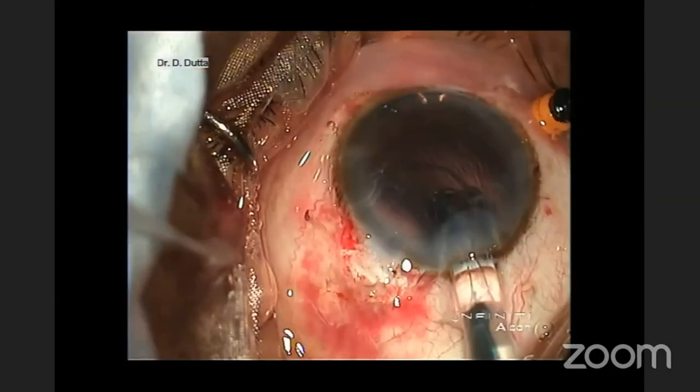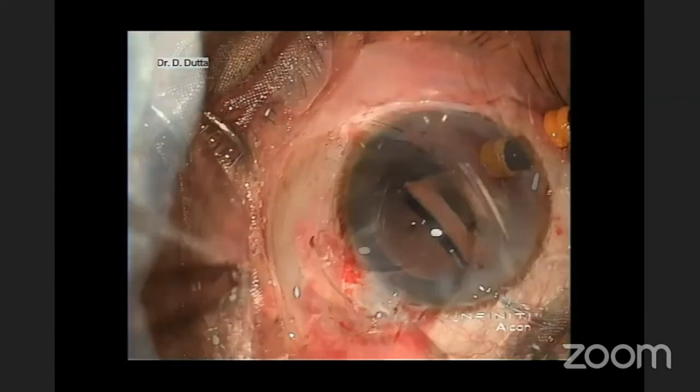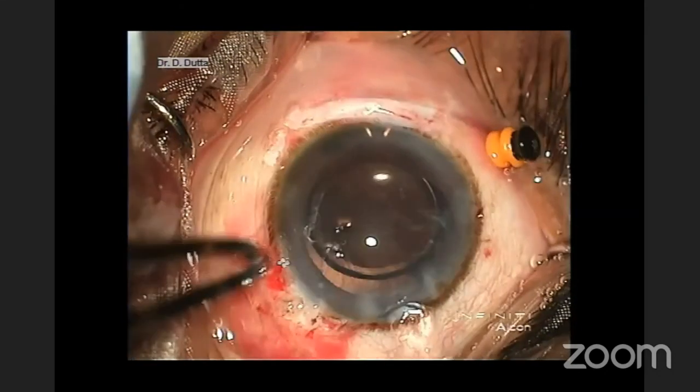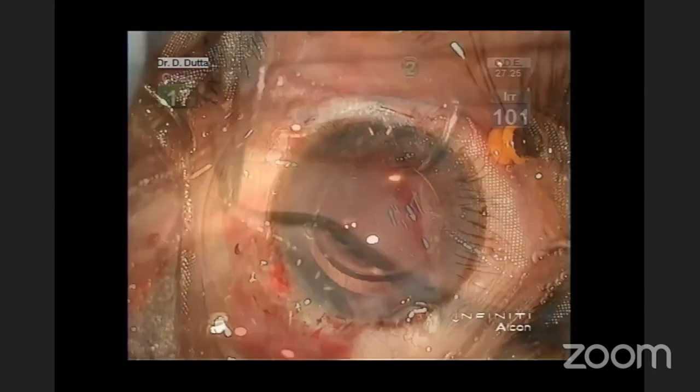I use the multipiece as we can salvage the situation by doing a glued IOL if the need arises. The knot is buried inside the scleral pocket. Conjunctiva is apposed.